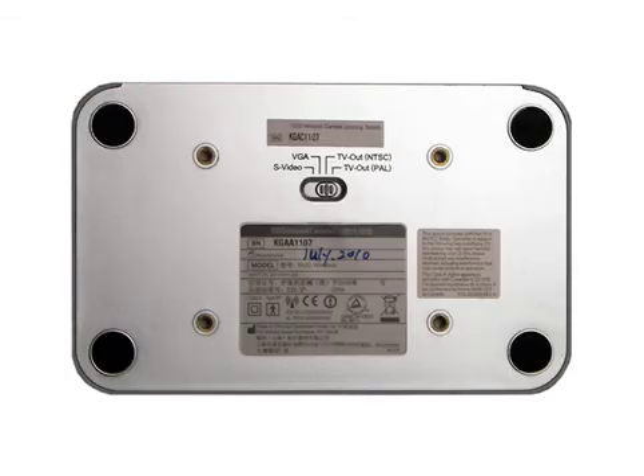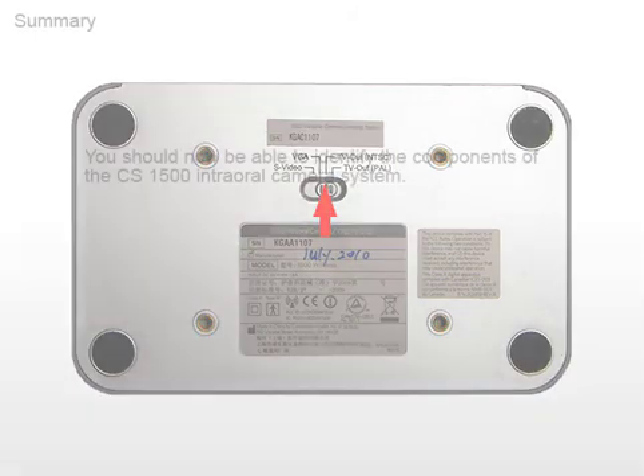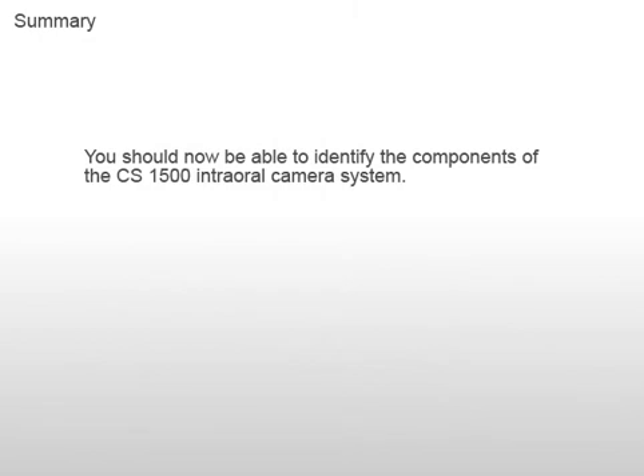On the bottom of the dock station are the mount holes for permanent installations and the video output selector. As you can see, the design of the CS1500 camera, wireless or USB, is simple and enables you to focus on what's important: your patients.